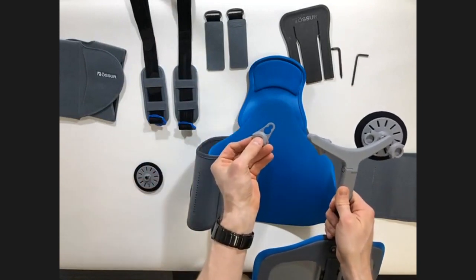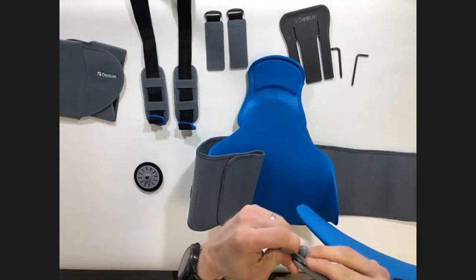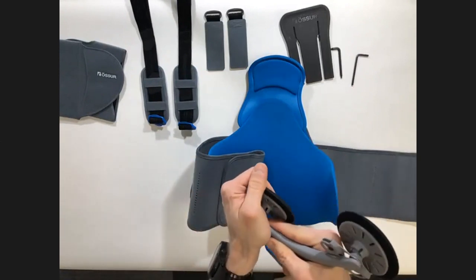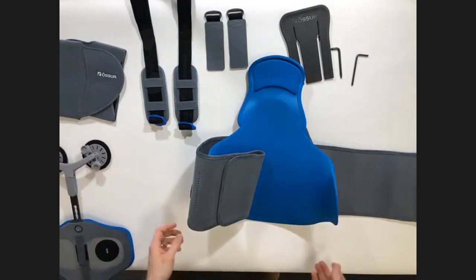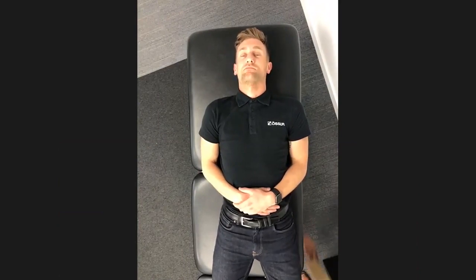So again, keyhole configuration, clips in like that, and then just slides into position like that. Okay, so everything's in situ, and we can then continue from there. So we slide that into position and we're good to go. Okay, great. So I'm going to take this over to Pete, and then we're just going to start fitting this. So we're going to go over to the camera above the couch.